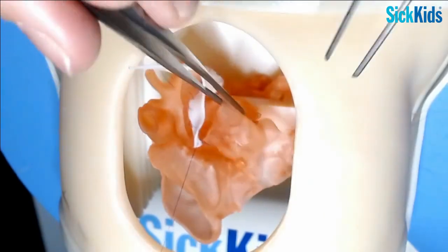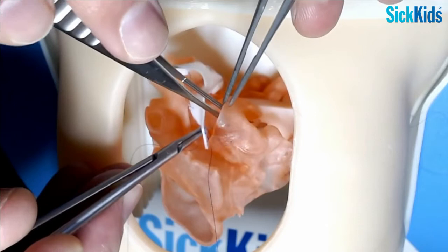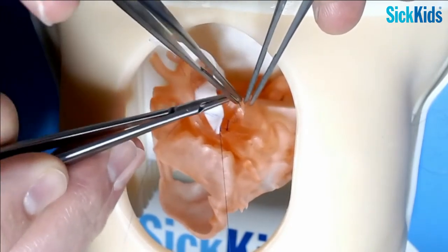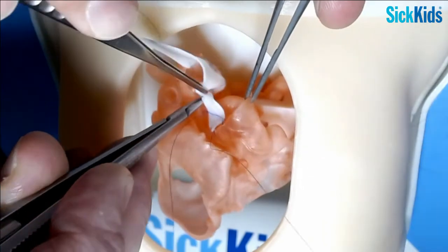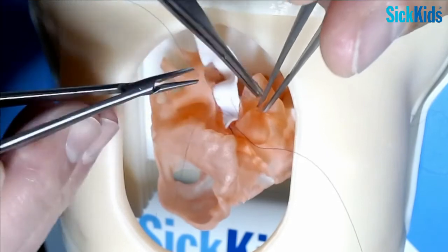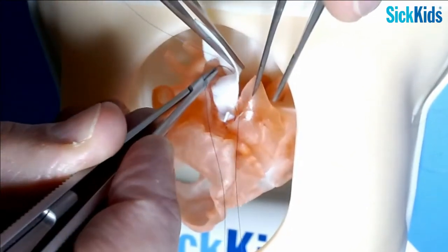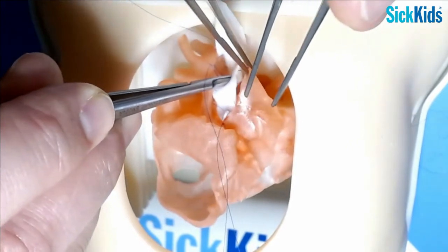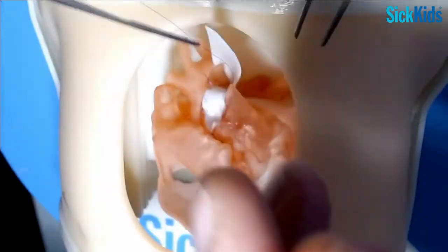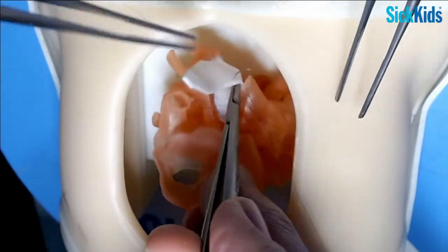So that comes down in here. Comes to here. And that should wrap around the top. Okay.